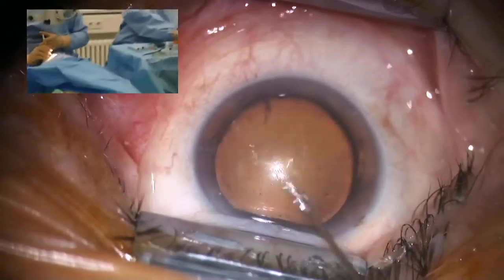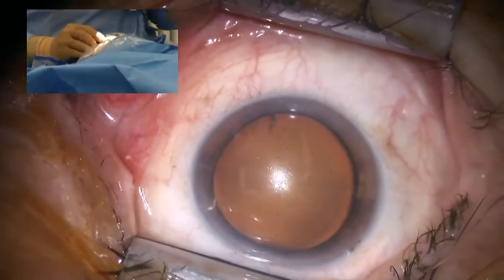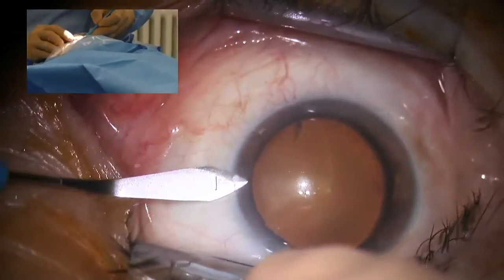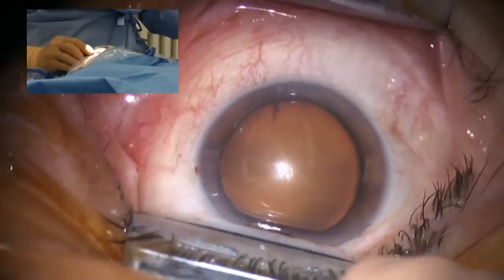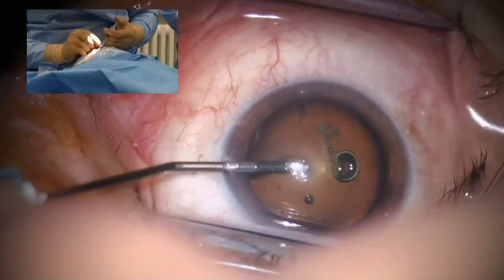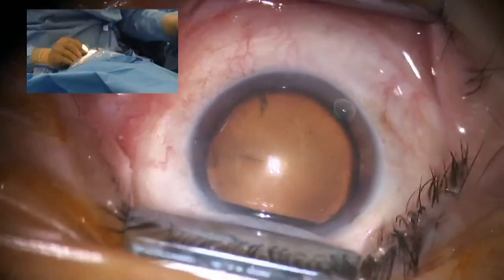Paracentesis, some lidocaine inside the AC to increase the anesthetic effect. A 2.0 millimeter clear corneal incision.